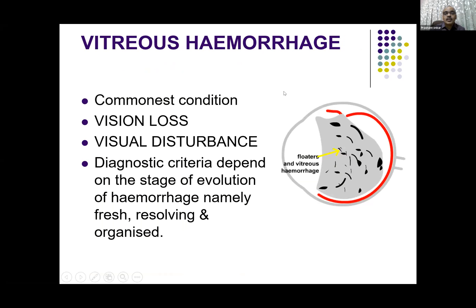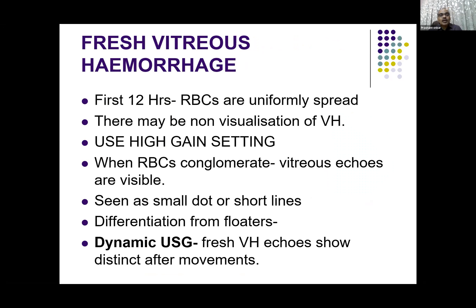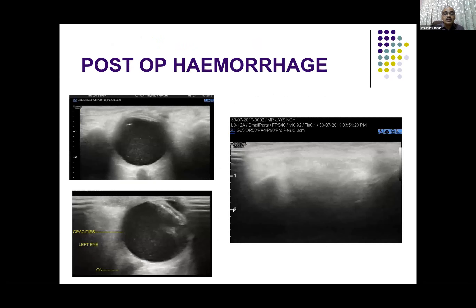Vitreous hemorrhage is a common condition wherein there can be visual disturbance and visual loss depending on the amount of hemorrhage. We can diagnose it as fresh, resolving, or organized vitreous hemorrhage depending on various findings. Initially the RBCs are very uniformly spread and may not be visualized. Whenever a patient with acute diminished vision or loss of vision and suspected vitreous hemorrhage comes, we use relatively high gain settings so that you can see those fine internal echoes. In very acute cases, as they conglomerate, the vitreous echoes are visible — seen as dots or lines — and we need to differentiate from floaters using dynamic ultrasound.